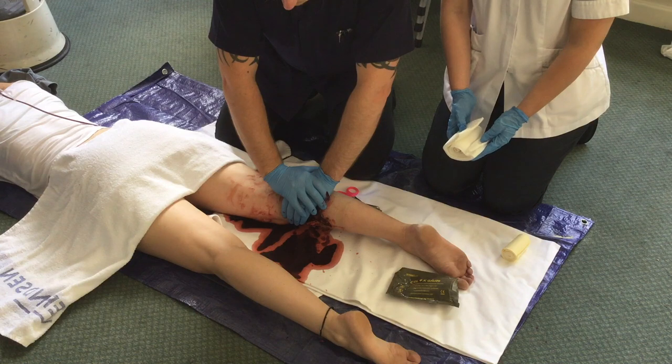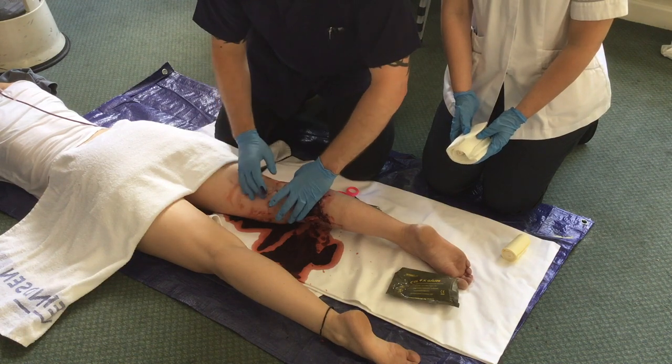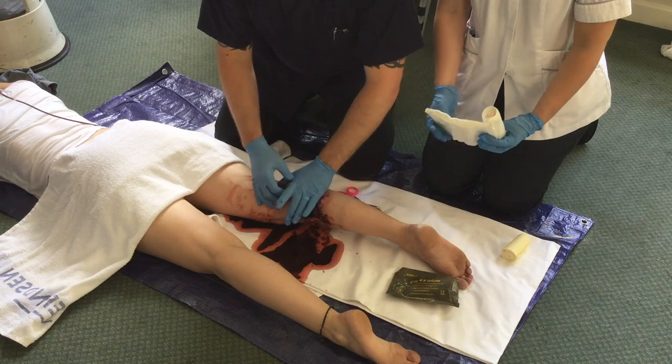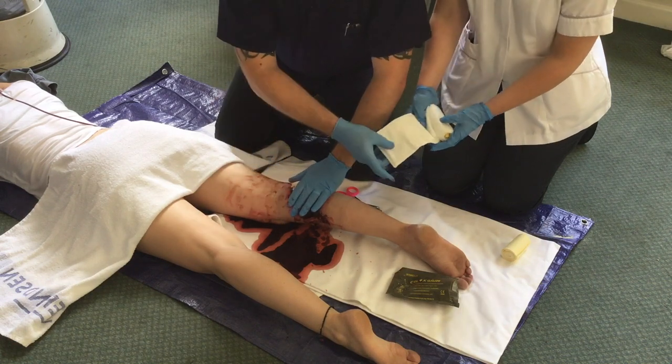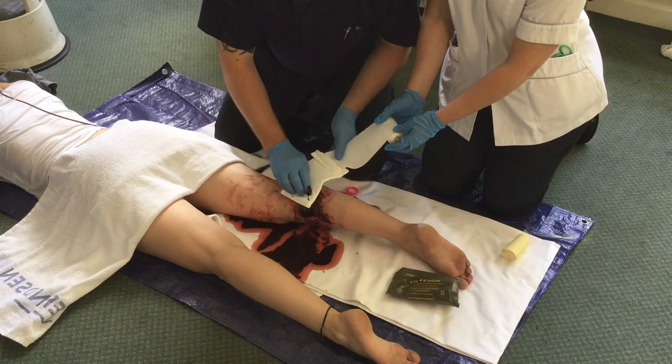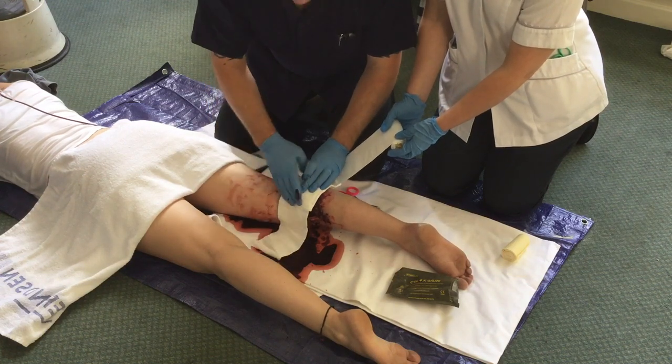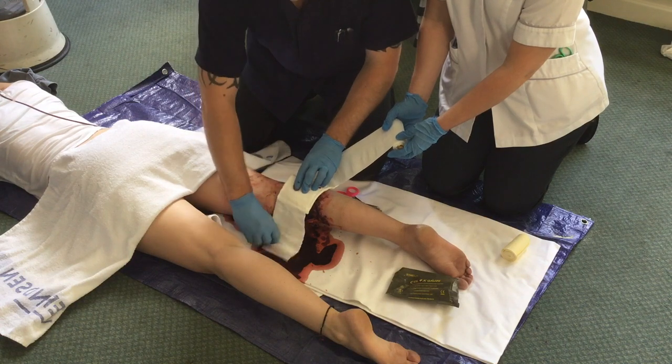At the end of five minutes the wound is inspected. If haemorrhage has ceased, a field dressing is applied and the patient is then evacuated. If haemorrhage still continues, more Seelox may be placed in the wound and further pressure applied for a further five minutes.